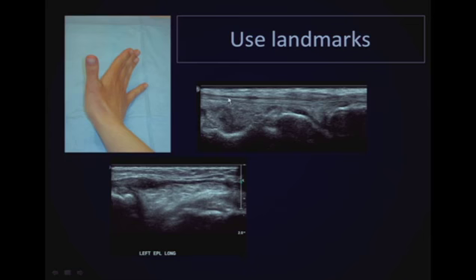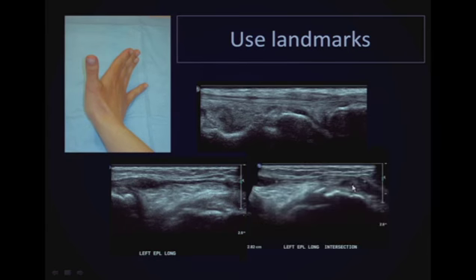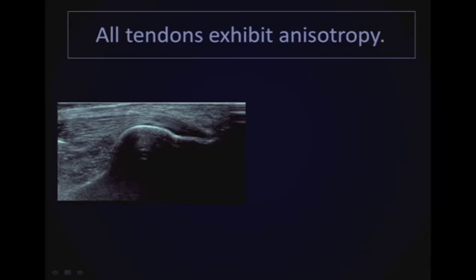She did not see the normal tendon structure extending across the image. There's an empty tendon sheath here. This is probably the free edge of the ruptured tendon, maybe here. You can see with a bigger field of view, you can see again the free edges of the ruptured tendon and the empty space where the tendon should belong. So this is a ruptured extensor pollicis longus tendon.